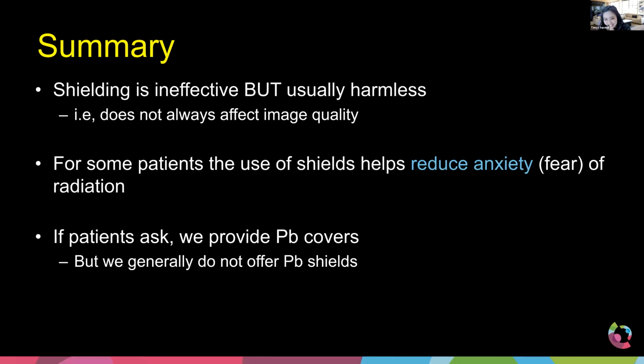Yeah. So there are times where we actually will image a pregnant woman. Let's say we're imaging her head. We just had in our institution a couple months ago a young lady that was pregnant, but she needed her head imaged. There was no question in our mind. We went forward. We did the CT of her brain. The amount of scatter coming from here down to here is almost negligible. I actually did the calculations. We also imaged her abdomen because we needed to, for her health. The benefit to the mother was that we needed those images. And she wasn't real far along, and she was actually a tiny little girl.